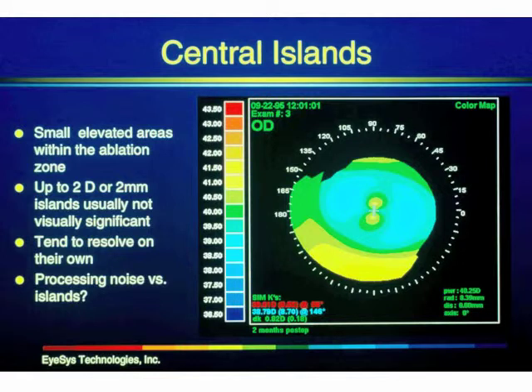The reason that I bring this up is that island is in the hole in the bagel. That island is in an area that's not actually being measured when we do our topographies. And some of the topography units can have holes in the middle of their data gathering that are even larger than 1 millimeter. 1 millimeter of the central cornea, that's the most important part of the whole cornea. And we're not actually gathering data from there. Okay.